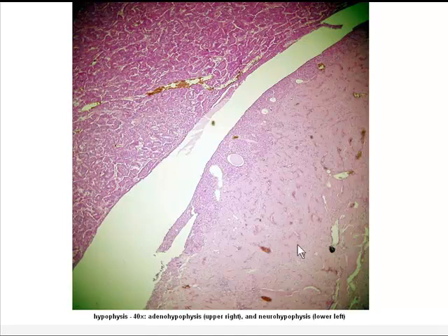So the neurohypophysis here is actually the posterior part, and it's made up of neural tissue. It's actually an extension of the brain, neurons that are coming down through the stalk of the infundibulum from the hypothalamus and releasing 2 hormones here. On the anterior side, this is actually glandular tissue, more similar to other endocrine glands, and this is where the remaining 7 hormones come from.